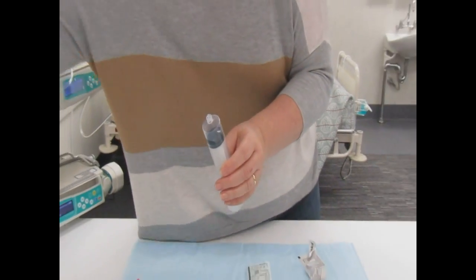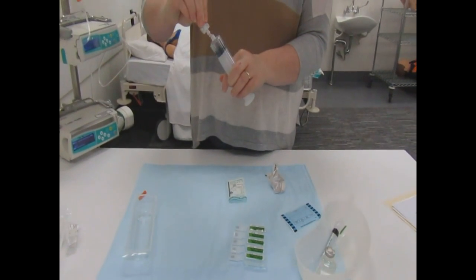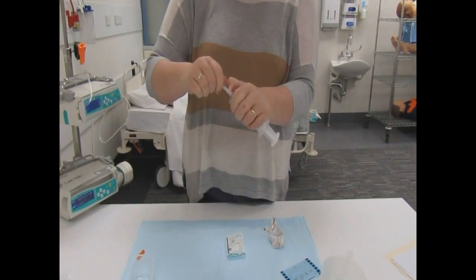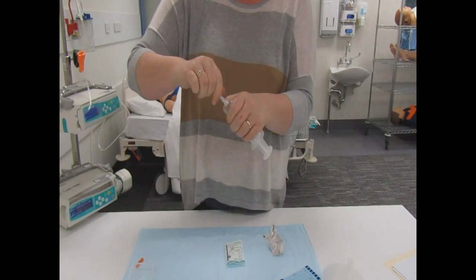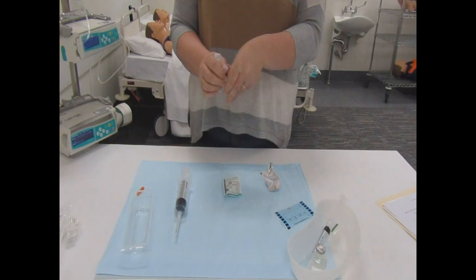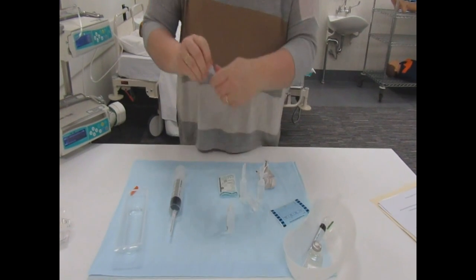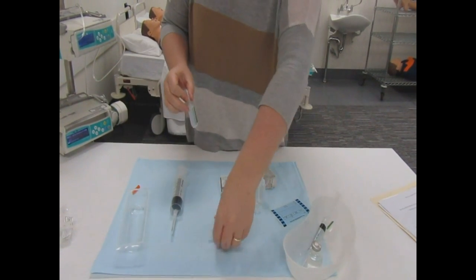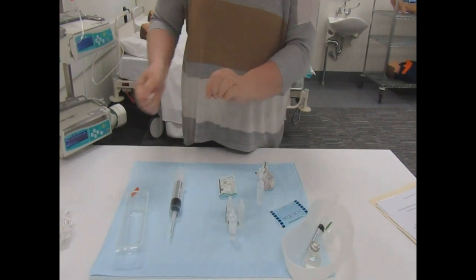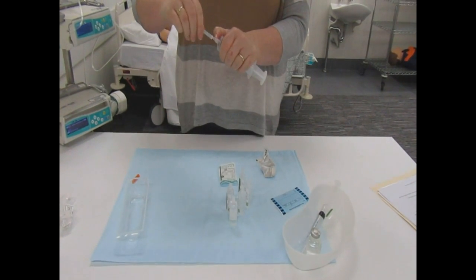The insulin syringe then goes straight into the sharps container. Something I should mention is that throughout this process I have a second RN checking every step. As students, you can do this out on clinical practice, however you must ensure that you have two RNs present with you, double-checking everything at each step. In some facilities, a double EN may be able to check with you — please practice as per your facility's policy.